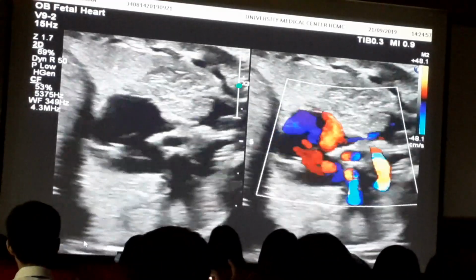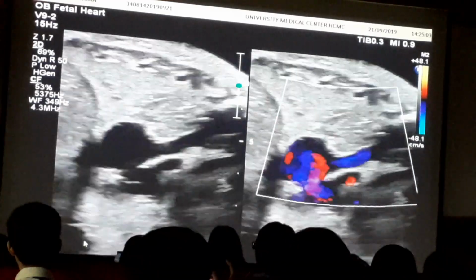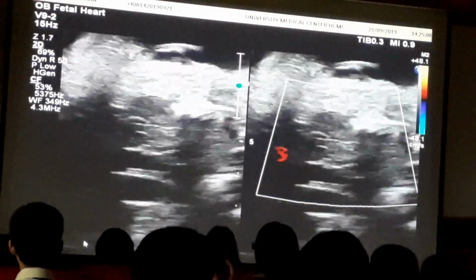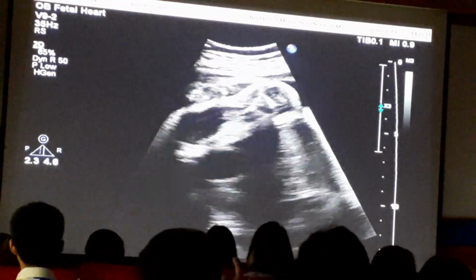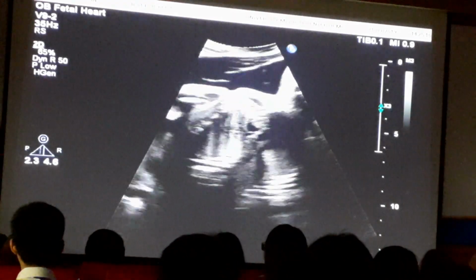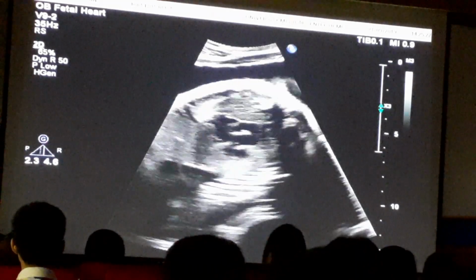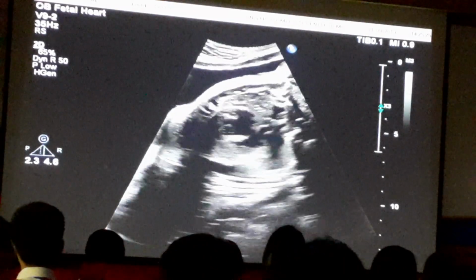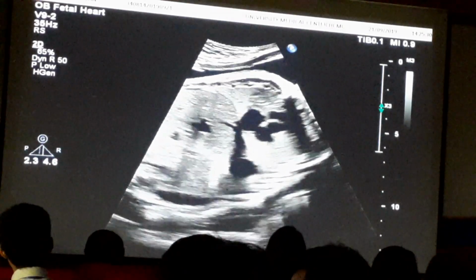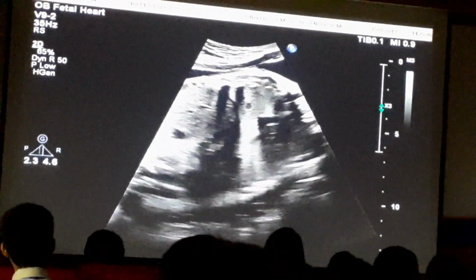The presumed CPAM could be further investigated with fetal lung MRI. Nếu bảo cho cô thì cái CPAM này chụp MRI để đánh giá, theo dõi thêm. Còn về cái tim thì đó mình có thể nó cần phải cấp cứu ngay sau sinh, nhưng mà cái cấu trúc chúng ta thấy van động mạch chủ, van động mạch phổi nhánh rồi không có thông thương thấp, thì tất cả những cái đó thì nó là dấu hiệu tốt. And we would want to look at the diaphragms too. There's one. So there's the right diaphragm, looks intact. Cái cơ vành thì ok.